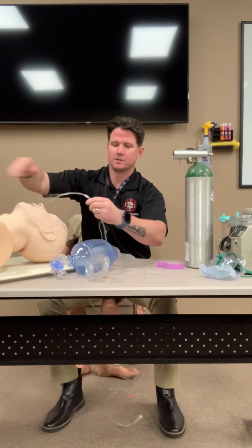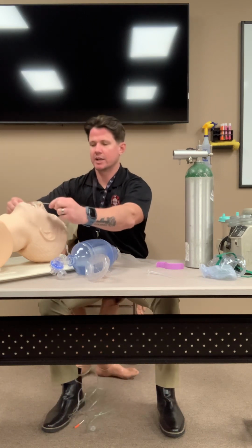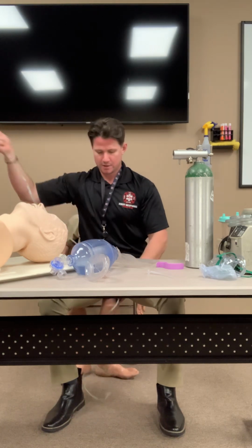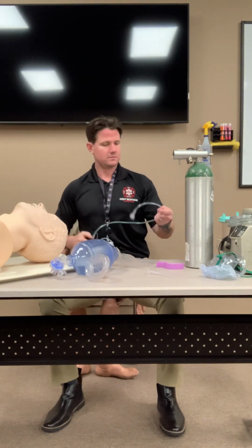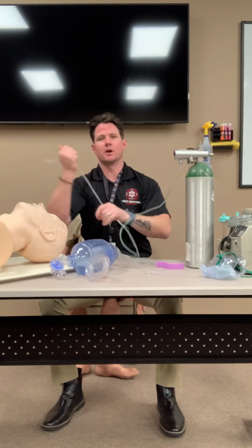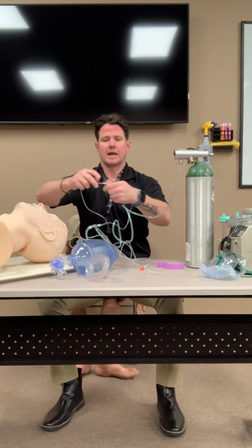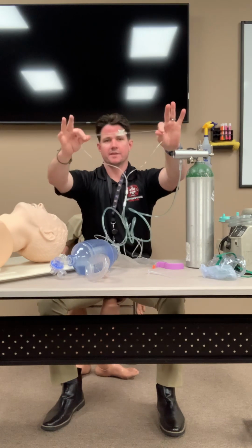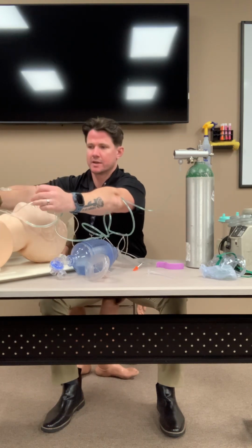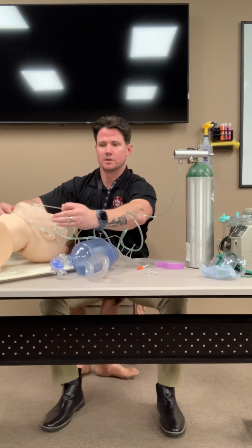it has this little cinch lock right here. If you just put this straight over their head and go into their nose, there's going to be nowhere to cinch this to. Okay, so what you're going to want to do is, after you plug this in, you set your flow. Like I said, 1 to 6 liters. Have the prongs facing you, right? And now take this whole thing and move it below the patient's chin, okay?